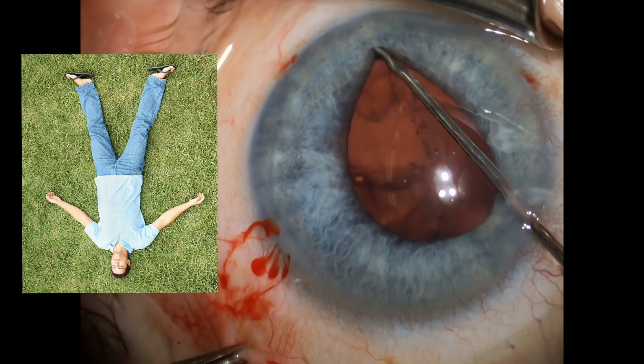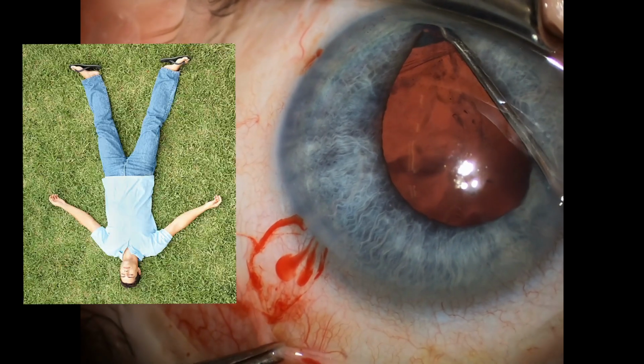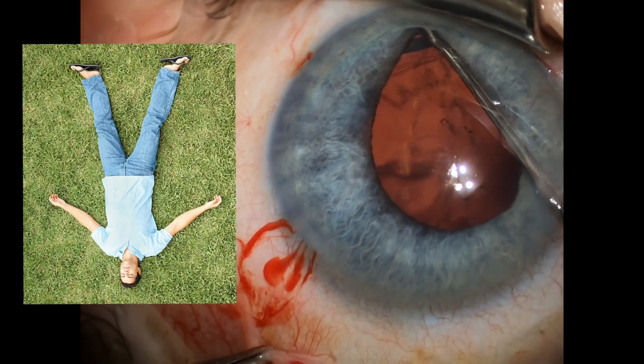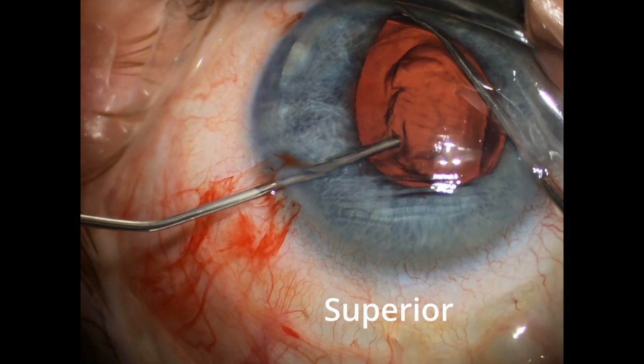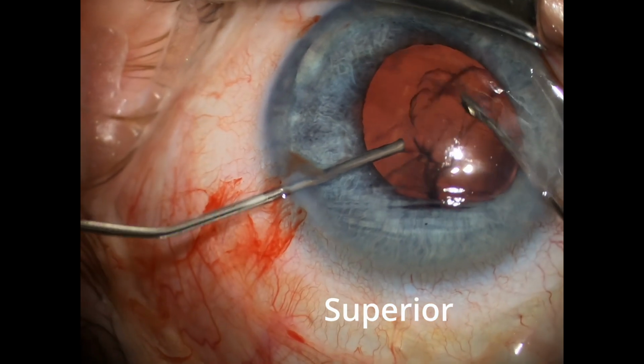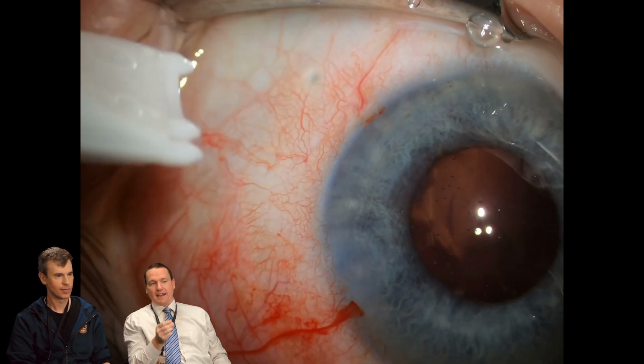So the bottom of the screen is the superior part of the cornea, the top of the eye. Inferior part. So bottom is the superior part. You're correct. Yes, you're absolutely correct. But I get it confused all the time. Correct. The bottom of our view is the superior part of the cornea. Yes. The top of our view, so everything's flipped is what we're getting at. Correct. This is filling up the anterior chamber with viscoelastic, still not finding that lens.